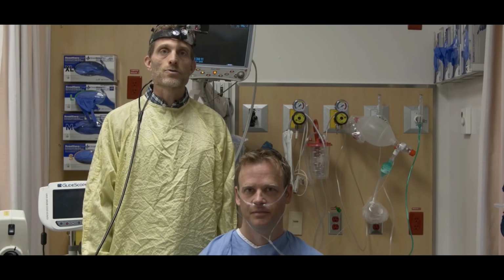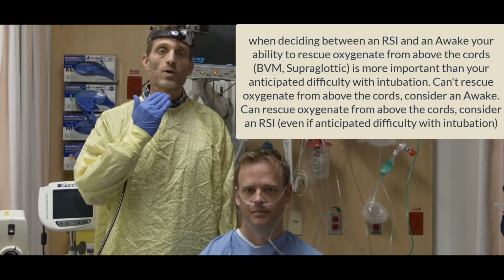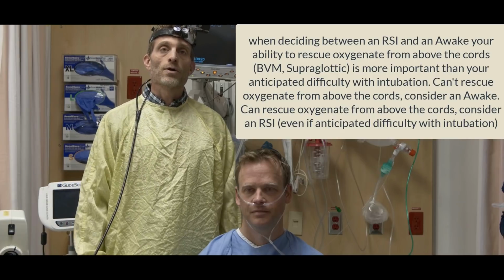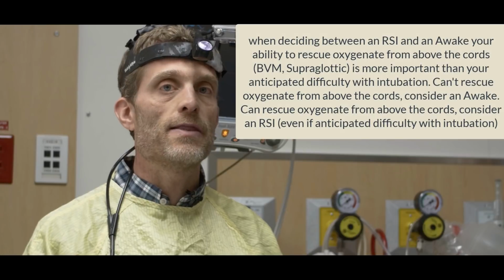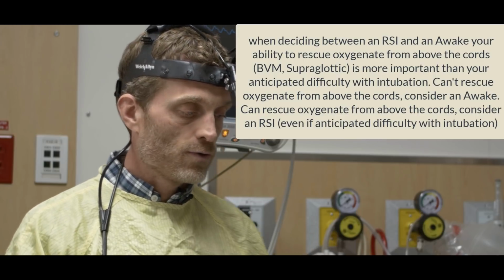Chad has some kind of upper airway obstruction that we are uncomfortable paralyzing him in the event that we can't rescue oxygenate him. If we paralyze him and then are not able to successfully rescue oxygenate him either with a bag mask device or a supraglottic, because his obstruction is still below those two devices, then we're heading towards the surgical airway, and that's kind of the classic indication for an awake intubation. So without further ado, we're just going to start.